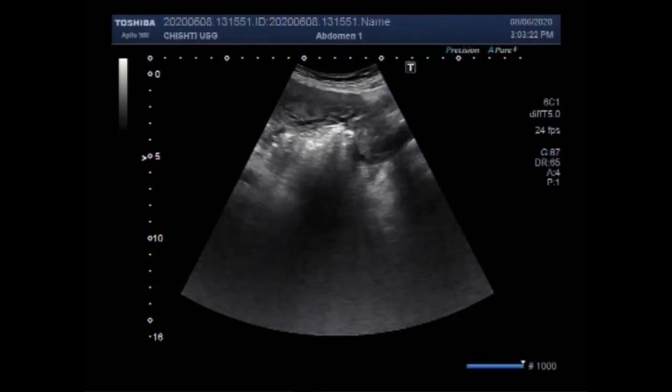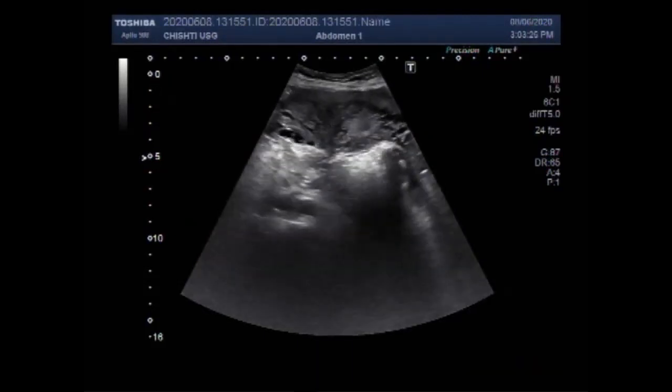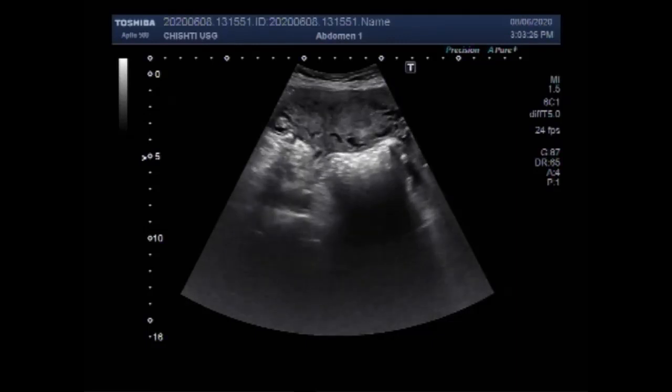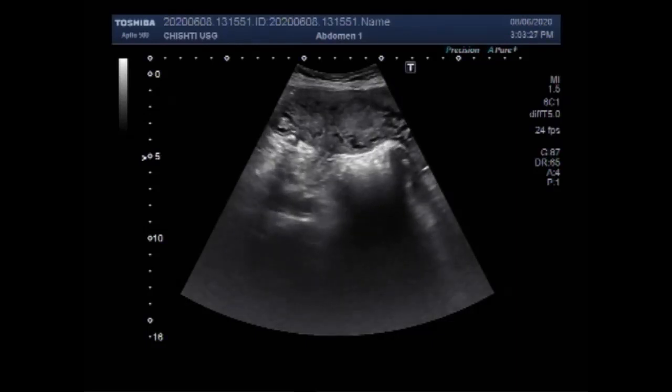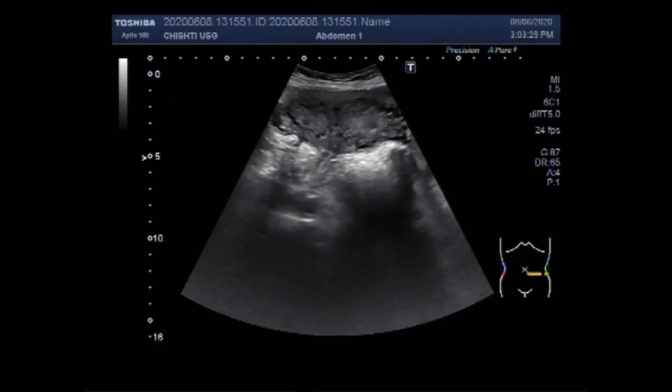Dear viewers, I hope you are all fine. This ultrasound video shows a large ovarian multiseptated cyst.